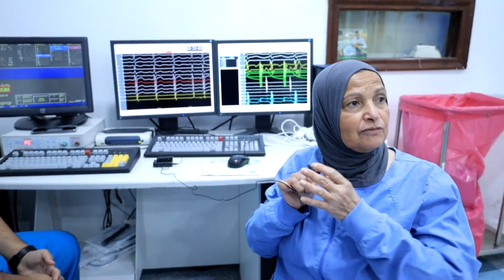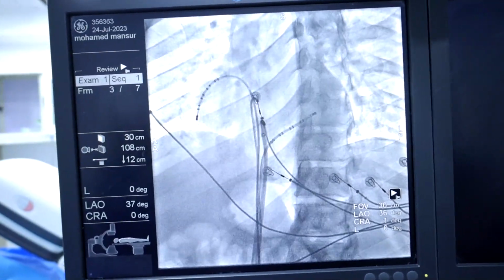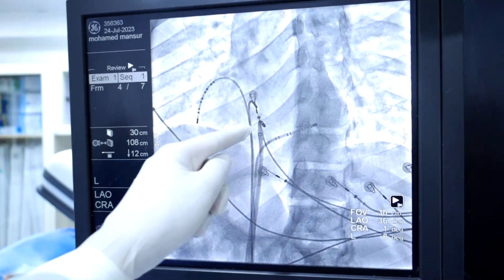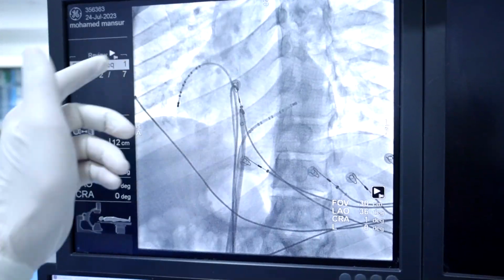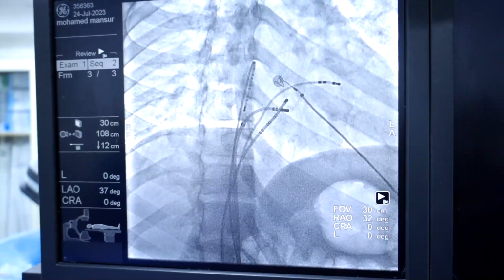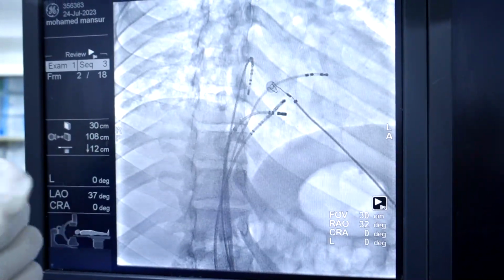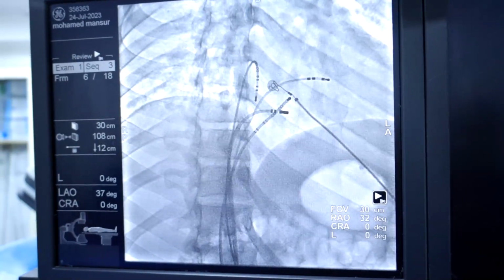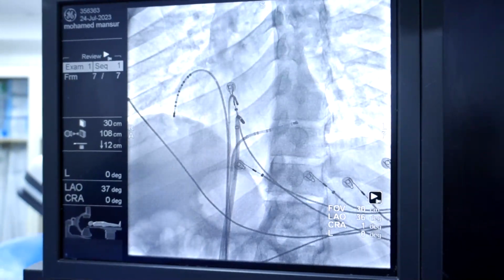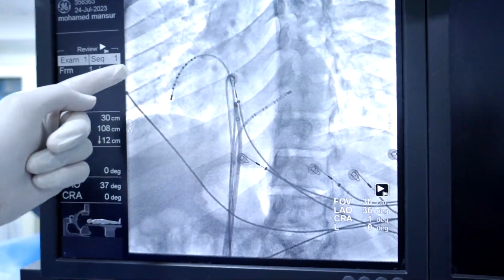Okay, show us where you ablated it. Come here on the fluoroscopy. The roof of the coronary sinus here. At this point, in the roof of the coronary sinus, after 1 second of ablation, the tachycardia terminated. This is the RAO view. Another view. The His catheter was in His position. You were posterior here, and the roof of the CS. Yes. The His catheter, the ablation catheter, the CS and the right atrial catheter.